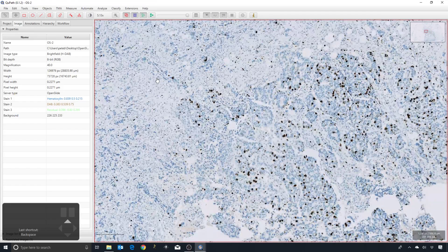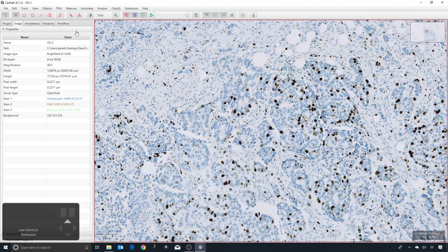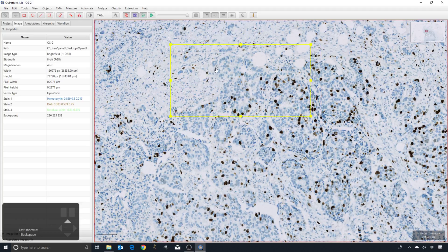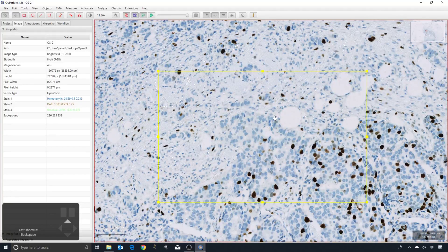Next, I'd like us to look at running some cell detection within this image. Whenever we run the cell detection, we've got a lot of parameters to choose between, and I'm going to explain some of them in a bit more detail. To give us the opportunity to optimize the parameters, we should select a region that contains a decent amount of variation in the cell types but is also quite small, so that we can run the cell detection very quickly. If we have a large region, it'll take longer.